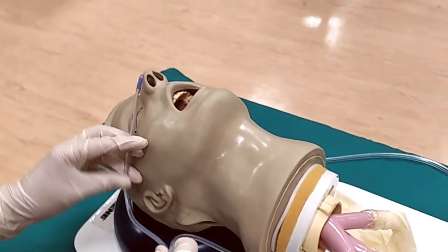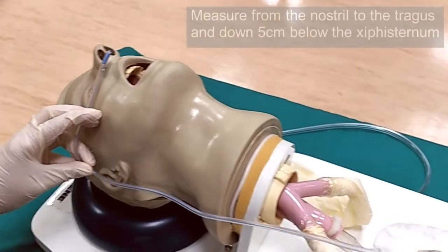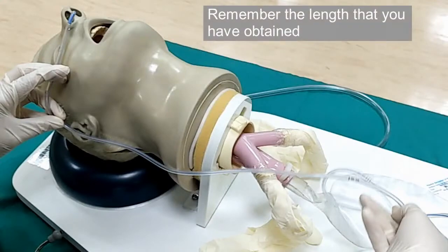First, measure the desired length of the nasogastric tube to be inserted. Measure from the nose to the tragus of the ear, then down to 5 cm below the xiphisternum. After measuring, take note of the length and remember the measurement that you have obtained as you prepare to insert the nasogastric tube.